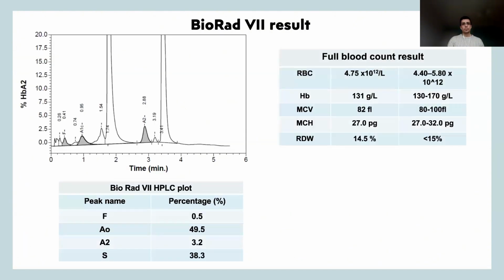As just showing a couple of examples, and I'm simplifying the report, just extracting the information that is necessary. For instance, being a hemoglobinopathy screening, it also needs to have some kind of hemoglobin separation technique with quantification of the hemoglobins, but also a full blood count. You need to have both, so you'll be able to diagnose the hemoglobin status of the patient fully.